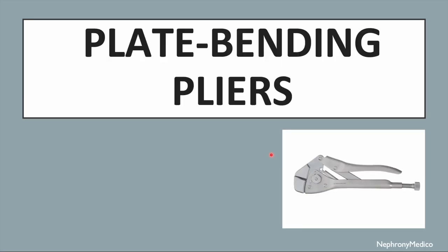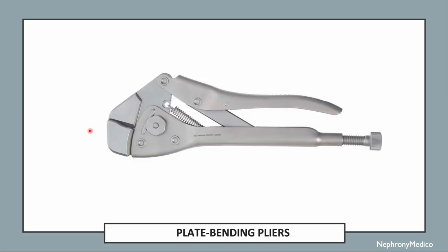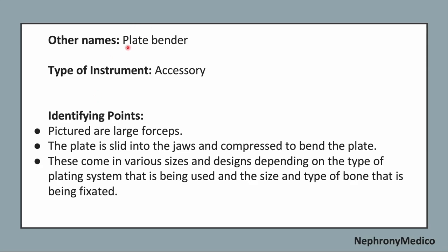Let's talk about plate bending pliers. This is a picture showing plate bending pliers. The other name is plate bender. It is an accessory type of instrument. Now identifying points. The pictured are large forceps and the plate is slid into the jaws and compressed to bend the plate.